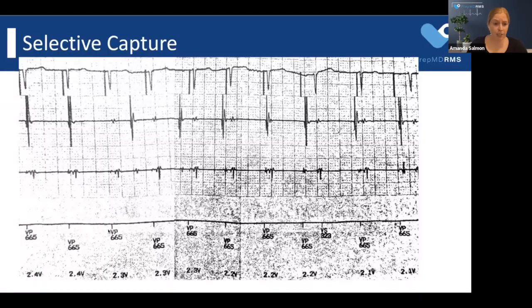So we're running this patient VVI, and when we ventricular pace, we have this little tiny deflection on our ventricular EGM, which, I'm going to give it away, spoiler alert for this particular patient, this is the His signal. This tiny little deflection is our His, and it matches up with our pacing spike on our surface ECG. After our His starts the depolarization, we can see the remainder of our depolarization following afterwards of the rest of the ventricles, which correlates to our QRS complex.